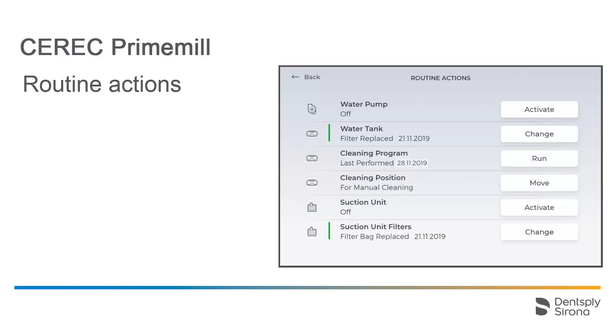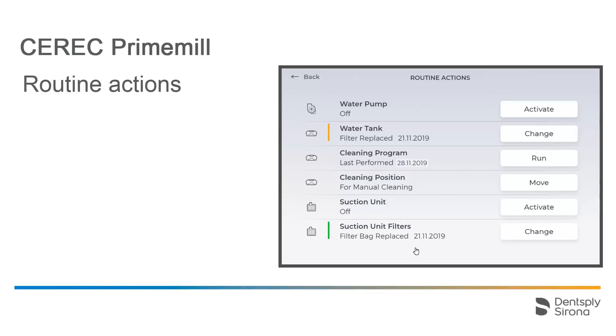The green marking with two of the Routine Actions options indicates that both the water tank, including the filter, and the suction filters are in good condition. If the marking changes to orange, as shown here, it indicates that they will need to be changed soon. When the marking turns red, the change must be performed.